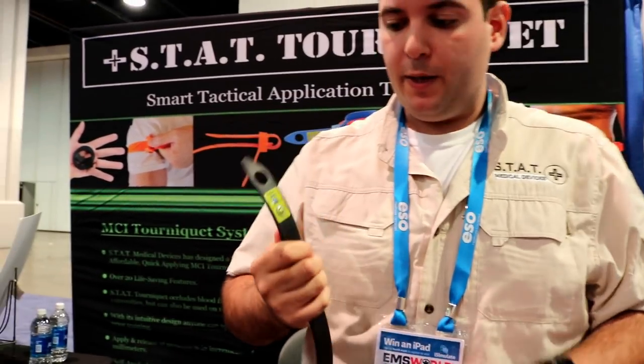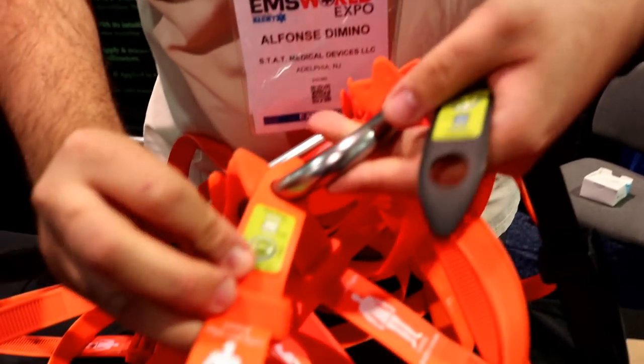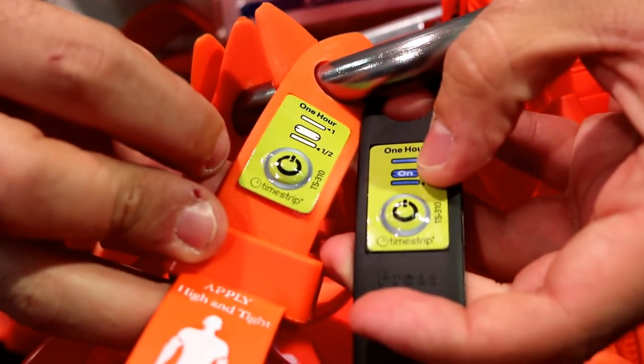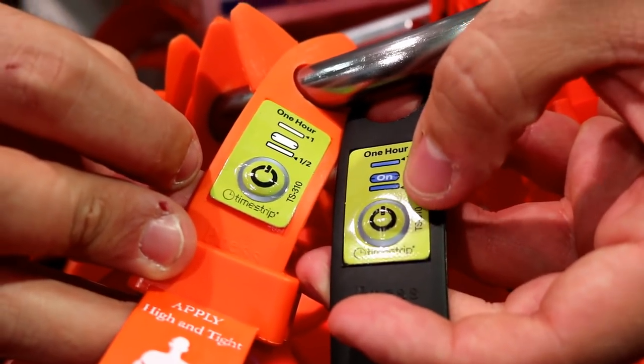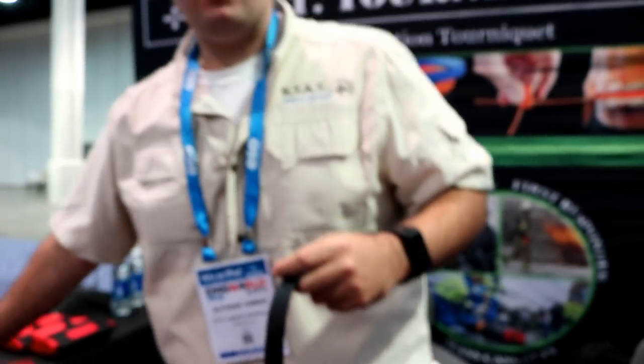This is designed for an MCI situation. We have a timer right here that keeps track of time for one hour. Initially you'll see it's all white. Once you press that tab, it'll start to show 'on' right away in that middle window. After a half hour, a blue mark appears. After an hour, another blue mark appears. This is really quick — in a mass casualty situation, you can cinch it down, press the timer, and you can also use it to prioritize your victims. It's a quick indicator to see how long the tourniquet's been on: before a half hour, after a half hour, before an hour, after an hour.